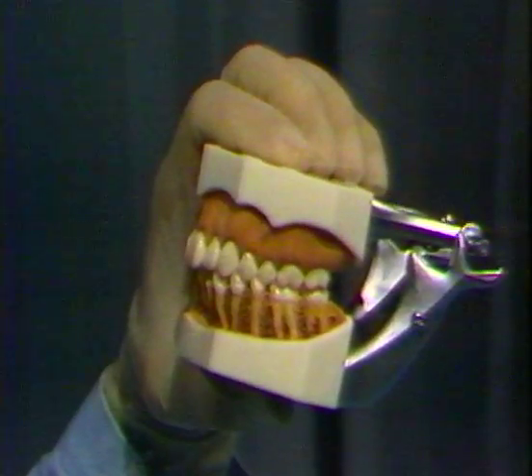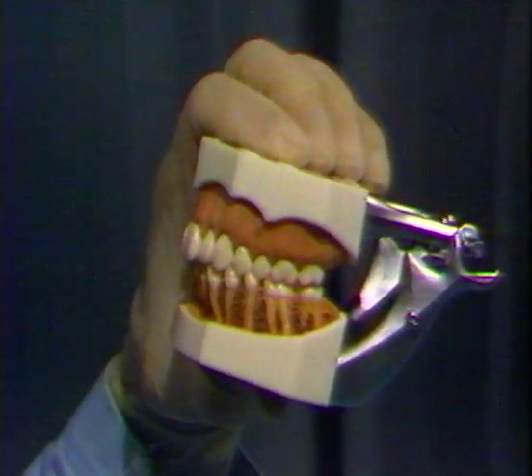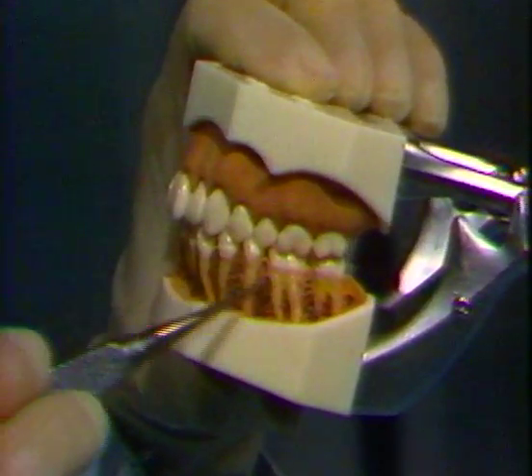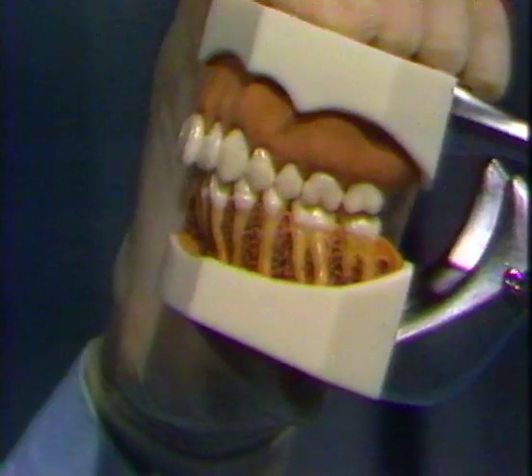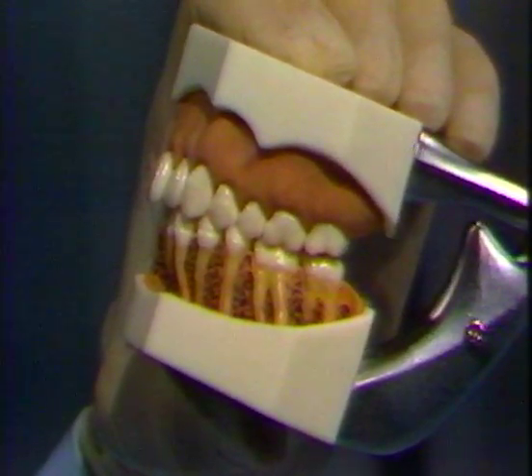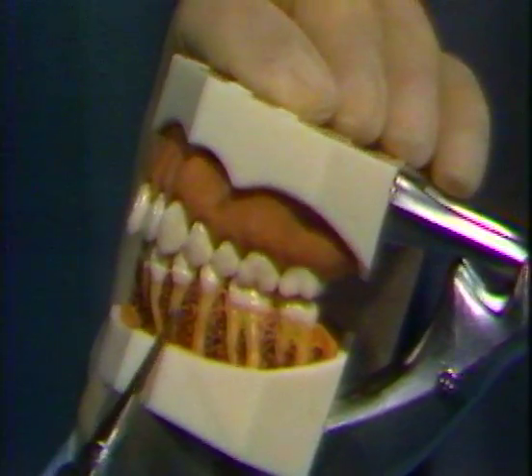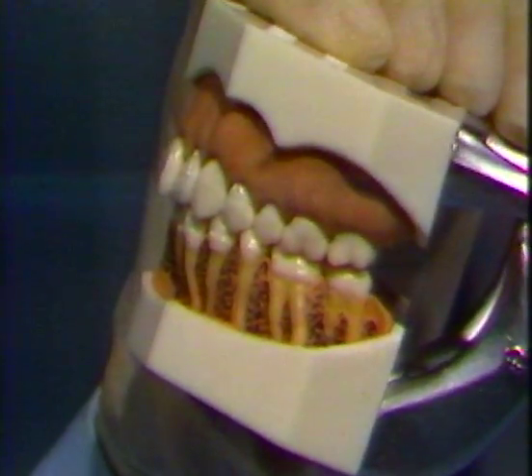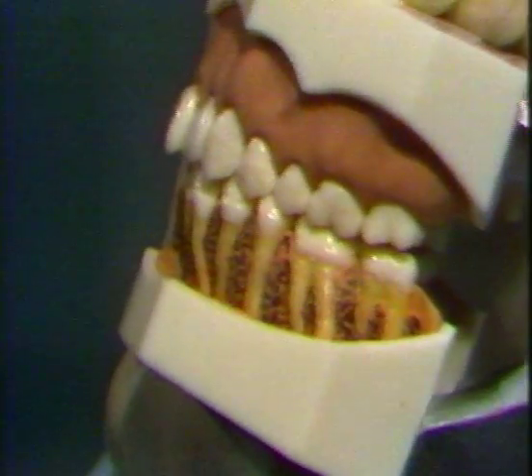The mandibular model has also had the mucoperiosteum and the underlying bone removed. Again, the student should note that this has been done for demonstration purposes only. The bone of the mandible is denser and firmer than that of the maxilla. As a result, the teeth are more firmly supported by the bone.